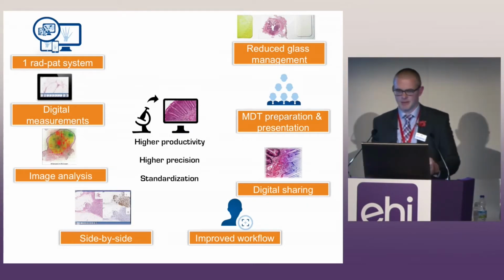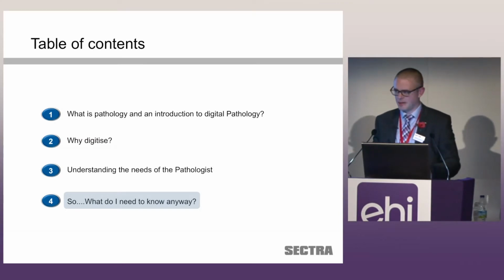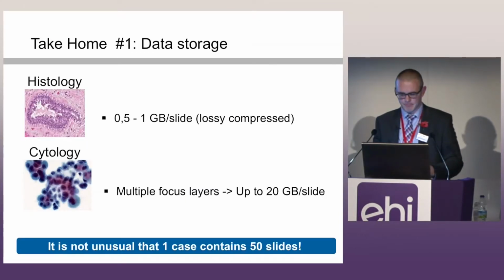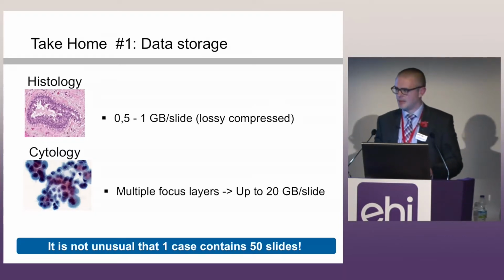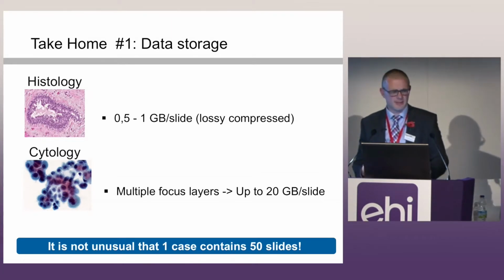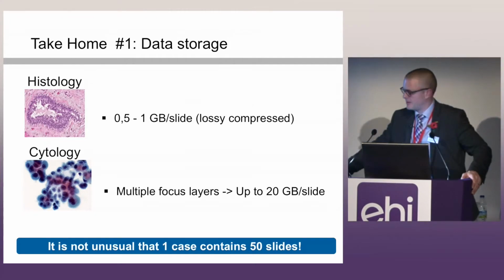Data storage is big, okay? These slides are extremely high resolution. As I've said, half a gig to a gig per slide is very typical, and some cases may warrant at least 50 slides in size, so significant.